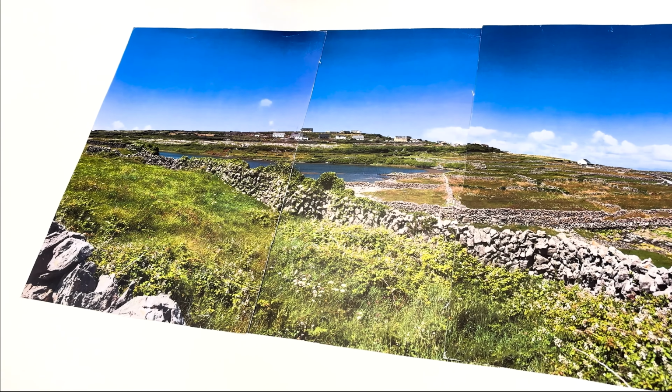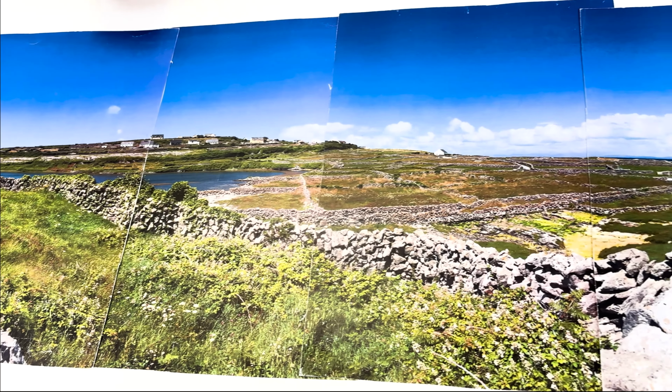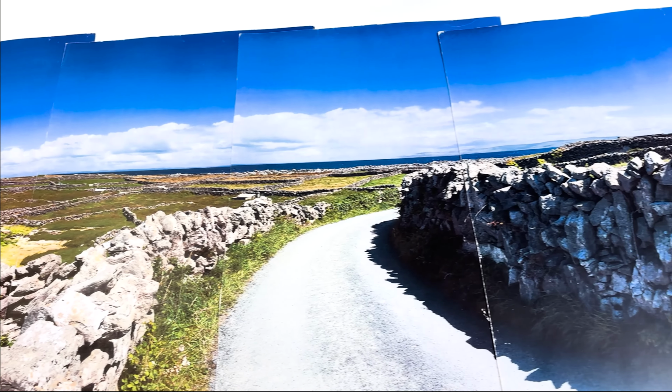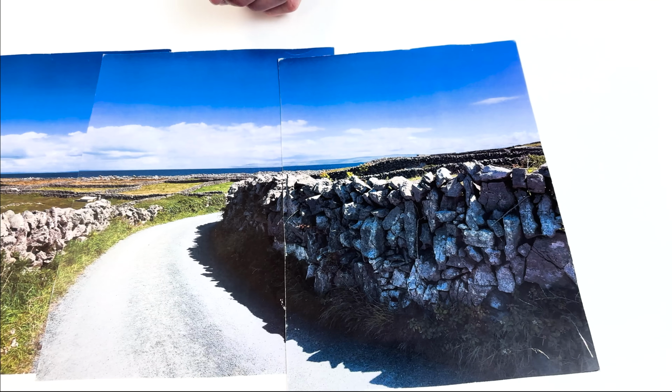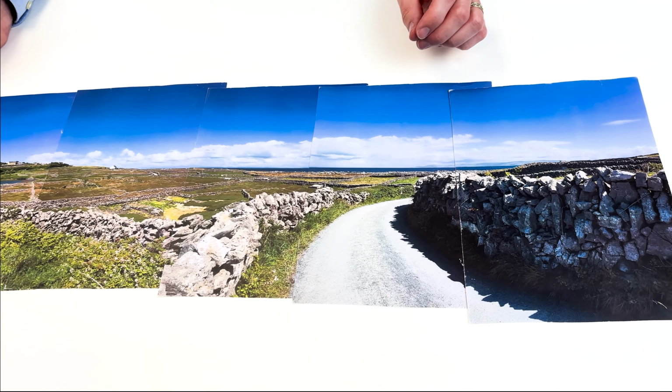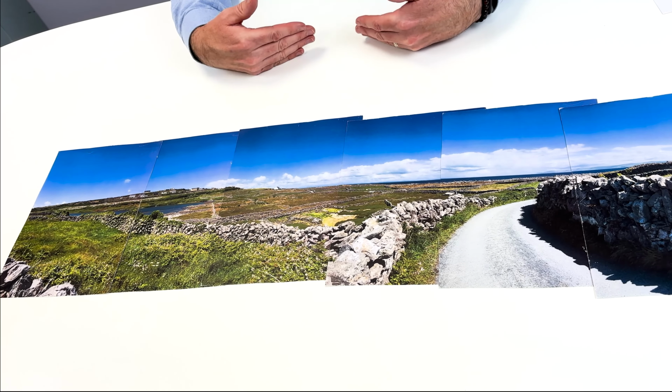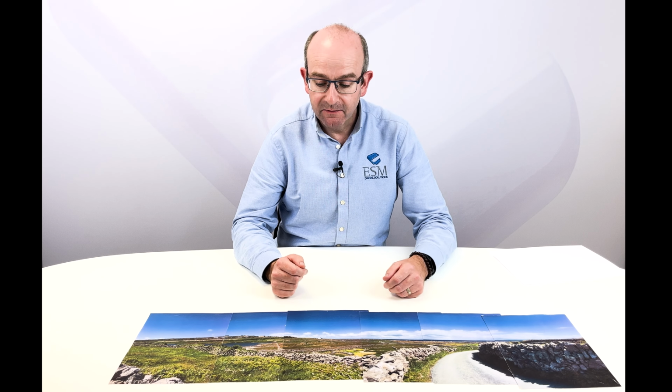Now, of course, for an intraoral scanner, we're taking thousands of images every minute, or maybe even every second, depending on what scanner you're working with. And the software is constantly stitching those together at a very, very high speed. So hopefully that's going to give you an appreciation for how fast and how powerful the software is and how powerful the computer needs to be in order to do that at that kind of speed.